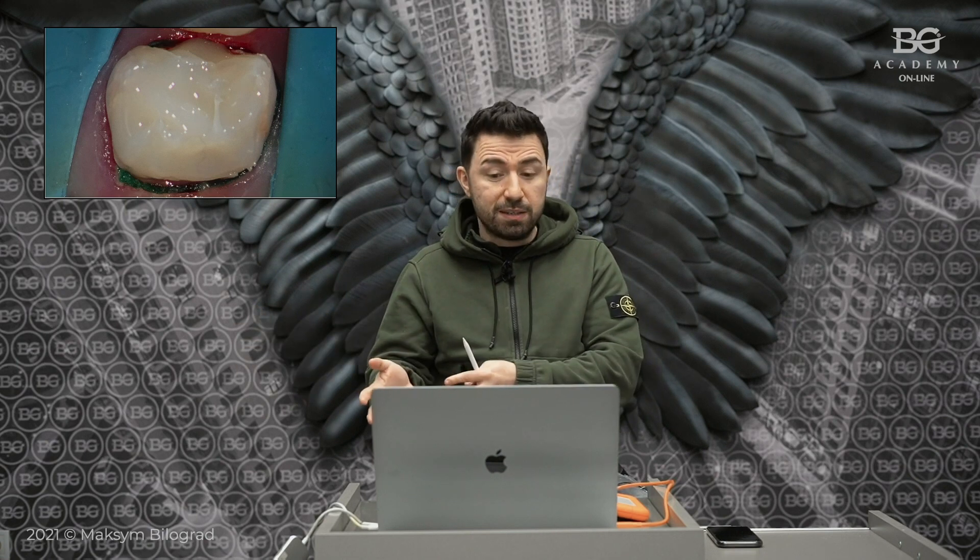I used the dual-cure core build-up material from BISCO — BISCORE or BISLIGHTCORE, I don't remember the exact product name. You can Google BISCO dual-cure core build-up material, or use any different brand — it's not an advertisement. There are many products like Luxacore from DMG, Core X-Flow from Dentsply, and many others. I like this one because when I prep it, the feeling is like prepping dentine — the material is not softer than dentine, which makes preparation more controlled.